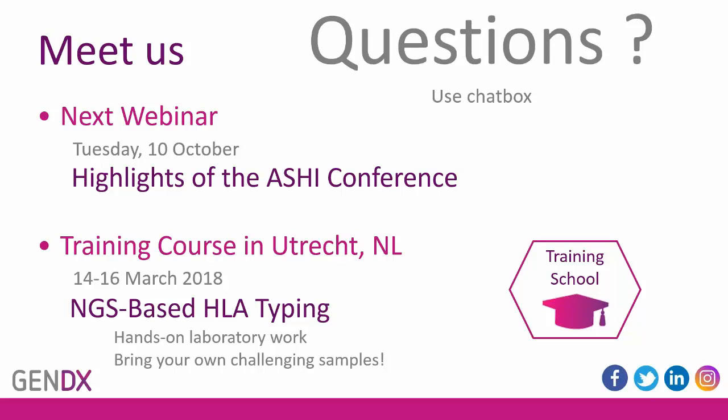First question, is this new protocol CE-IVD approved? Yes, so we have the new cleanup protocol that is now part of the CE-IVD protocol. On the website you will find two IFUs, one for people that would like the RUO version and one for the people that would like the CE-IVD workflow. So yes, it is CE-IVD approved.